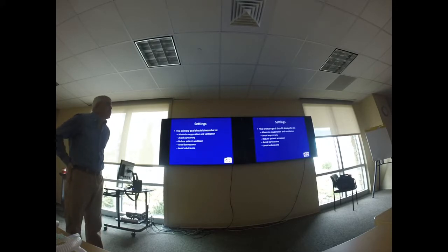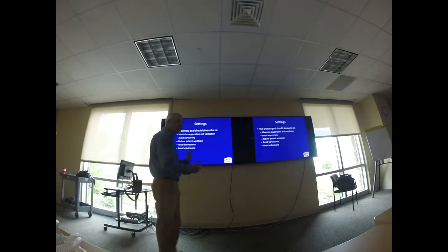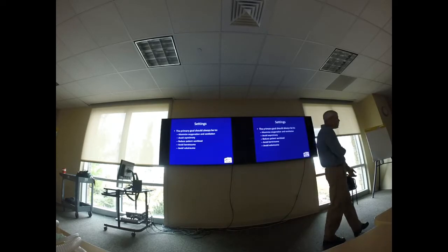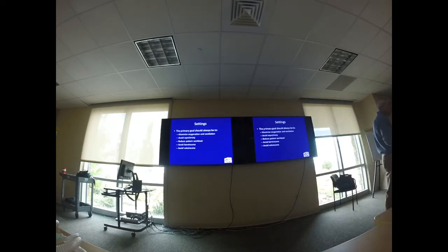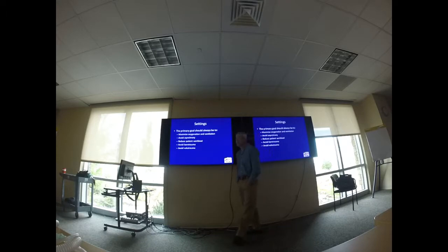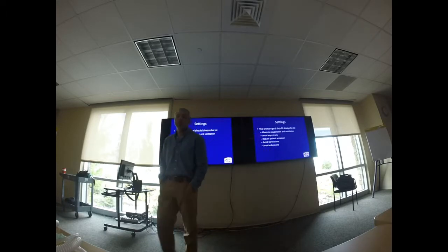All right, hey guys, so we've talked about just some general concepts and terminology associated with ventilation. We've talked about minute ventilation and how it's inversely related to end-tidal CO2 or PaCO2. We've talked about peak inspiratory pressure. We've talked about plateau pressure. And we've talked about non-invasive modes of ventilation.